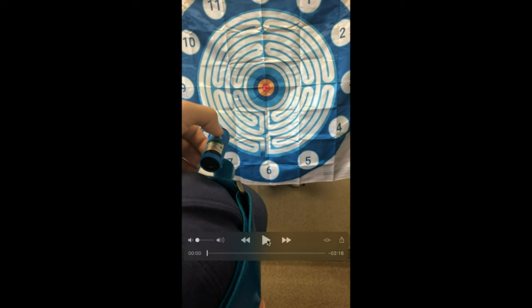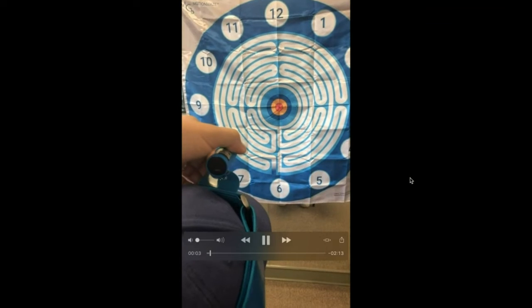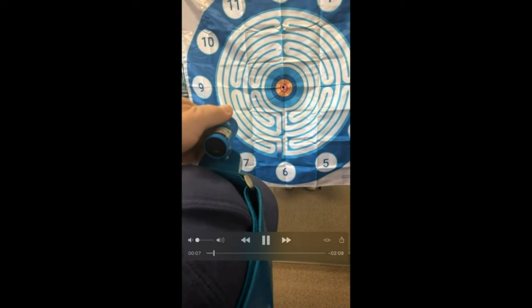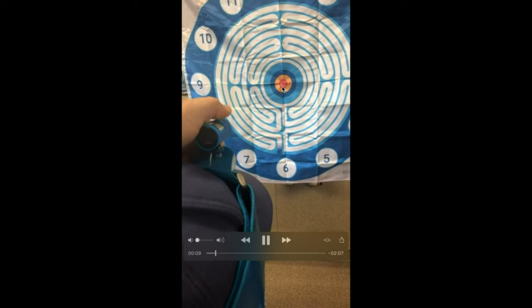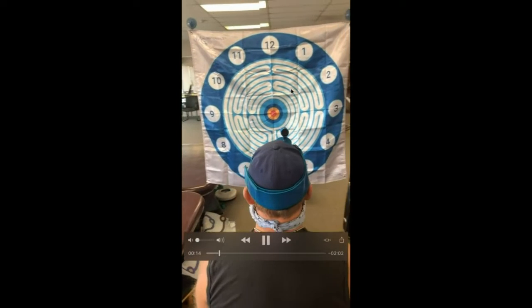So if we look at this gentleman doing the standard testing, beauty of the ball and socket joint right here is that he can look at the center target, and then I'm moving the laser down into it. Don't have them move it down into it. They want to keep their original posture there.